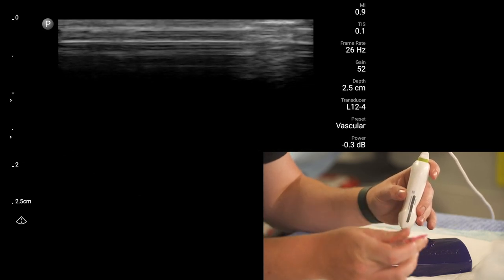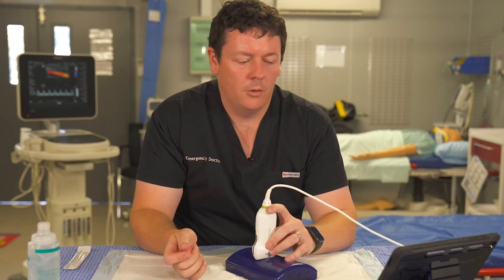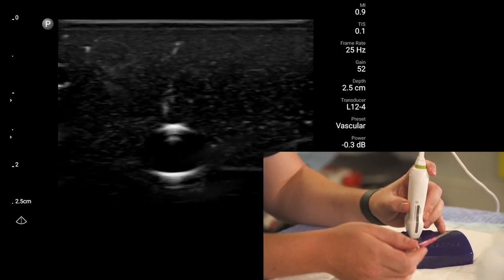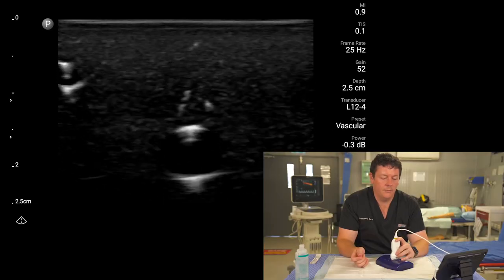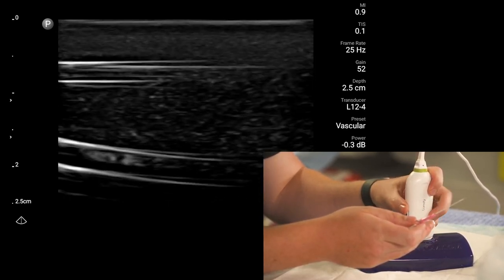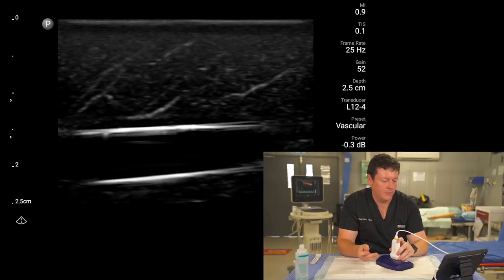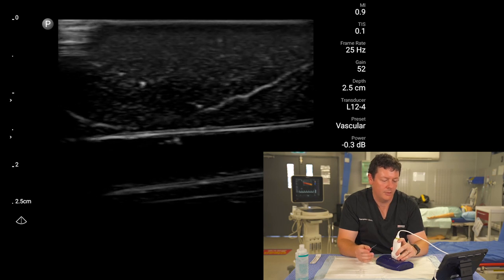Now for in-plane technique. Track your vessel along its length to find a nice straight segment for vascular access, or locate the nerve if using for nerve blocks. Practice rotating the probe on the vessel — come across until you get that nice tubular structure which will be your target.